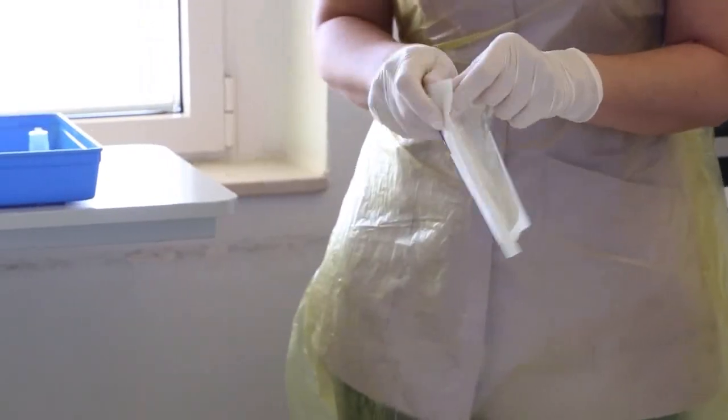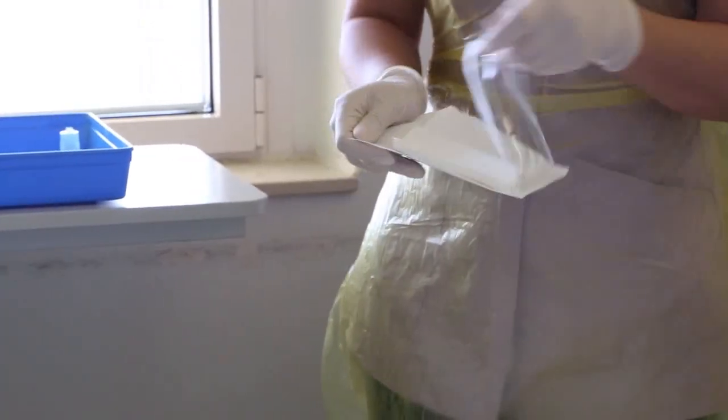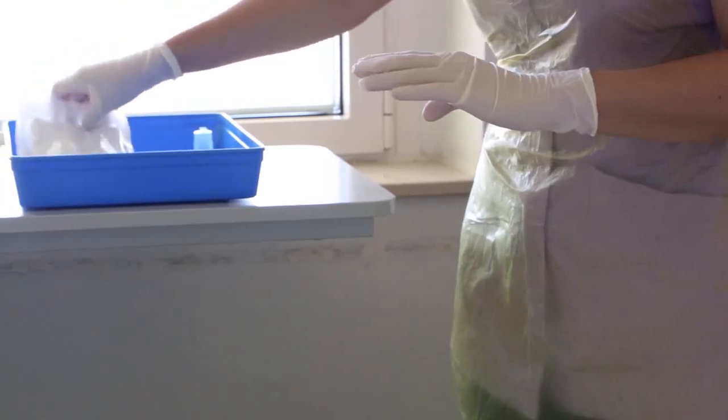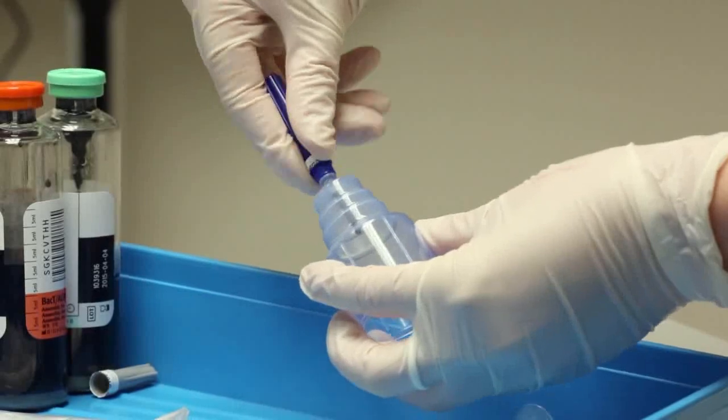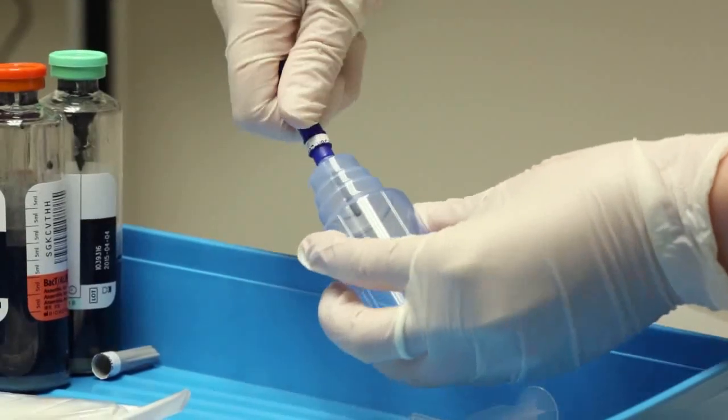Open the gauze swab package as shown and without touching the swabs, place it back in the tray. Attach the blue vacutainer needle to the blood culture vacutainer and place it back in the tray, leaving it covered to maintain a sterile connection point.